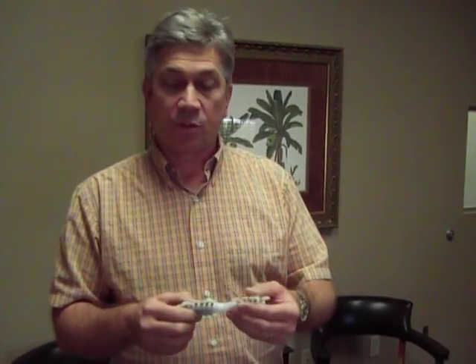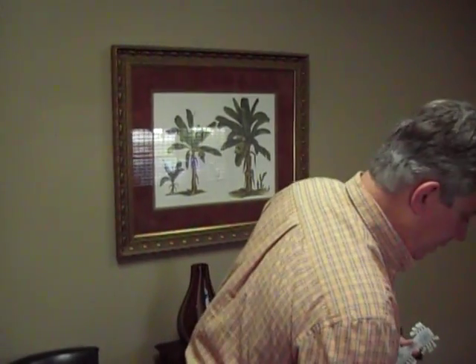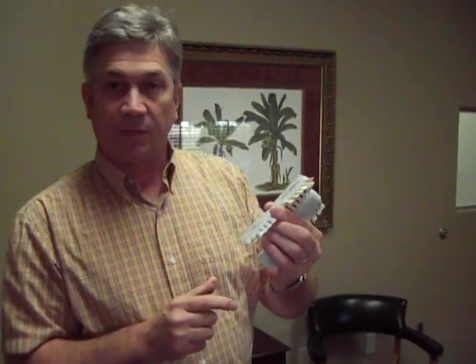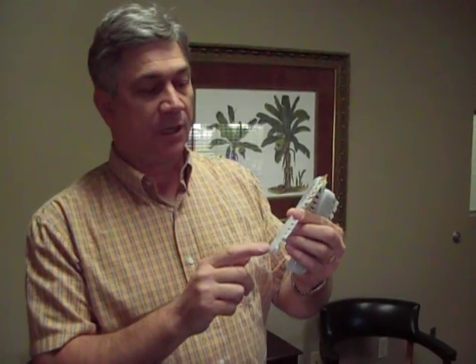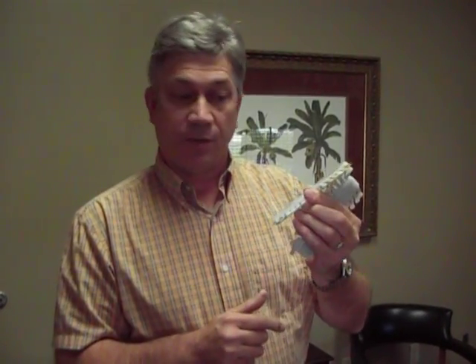You can quickly see, because it's just one color on these shade tabs, because I have colors that match each bottle of porcelain. Once I determine the basic color of that tooth, then I'll pick up another guide right here. This has opalescent colors. Then I'll look at it and start looking at incisal colors, trying to determine what incisal porcelain I'm going to use. And then you can do this very easily. All you have to do is put each one of these tabs up to that tooth. It'll reveal to you if that color is in that tooth or not.